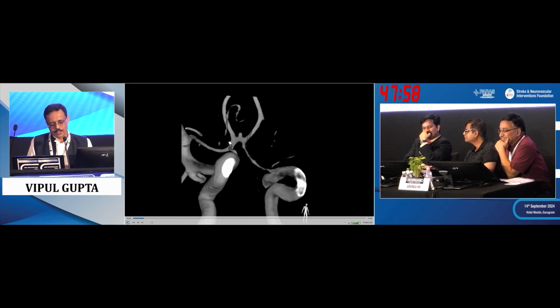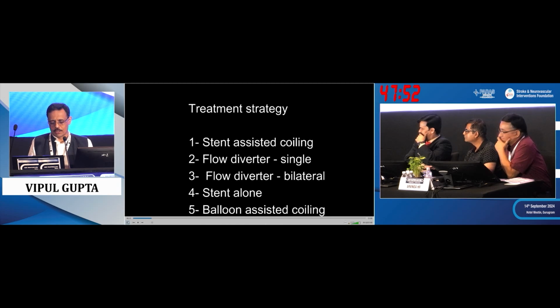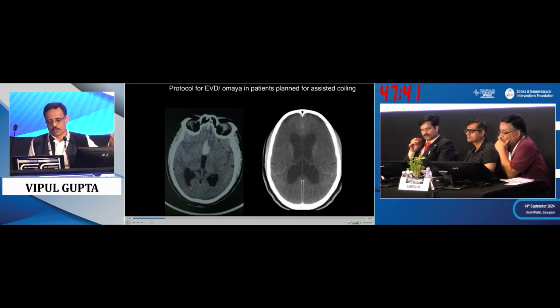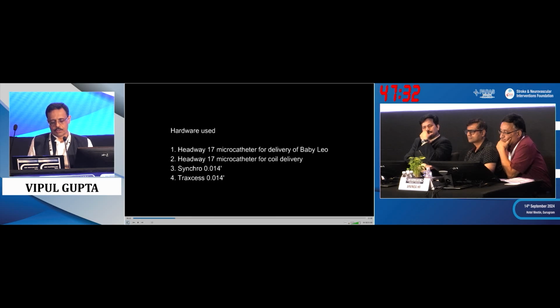So anyway, we did it. The problem is how to catheterize this aneurysm, and there is nothing there. You place the microcatheter, there is nothing left. We never try to catheterize such aneurysms when they are very, very small. This is blister-like, but to me it's a saccular aneurysm. It's a classical location. Again, a thick clot, hydrocephalus, so you have to get a drain in before you proceed. You want to have your neurosurgical consultation before, so we got an EVD done. We keep the drain on a little bit so it doesn't get blocked off by blood.